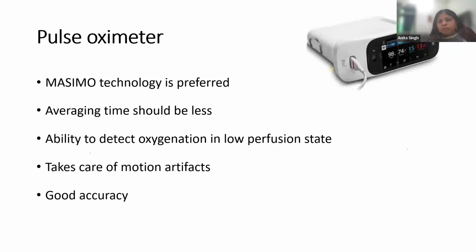In the case of methemoglobinemia, what we observed was that the pulse oximeter was also showing a methemoglobin level. So it is a non-invasive way to monitor the methemoglobin level, and there are the co-oximeters from Masimo, which can give you a real-time continuous display of methemoglobin levels. They can also give you a carboxyhemoglobin level or sulfhemoglobin level by use of special sensors. So that can be possible.